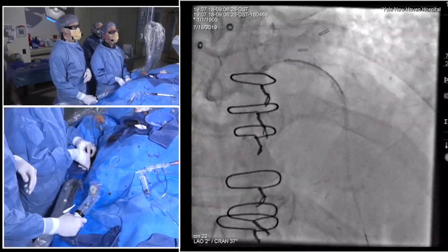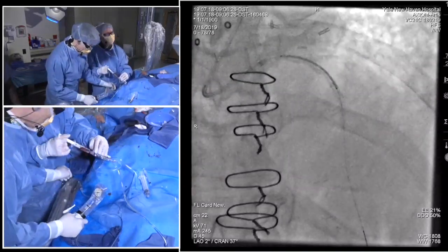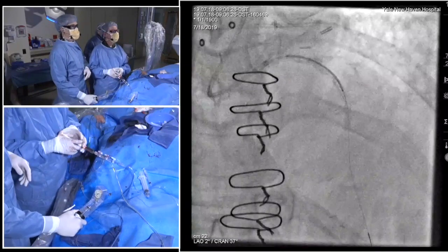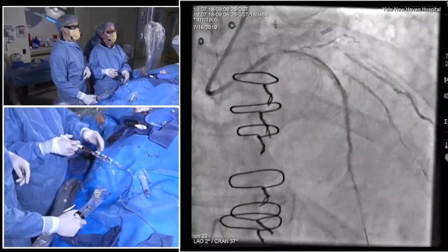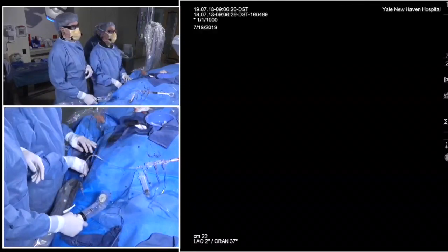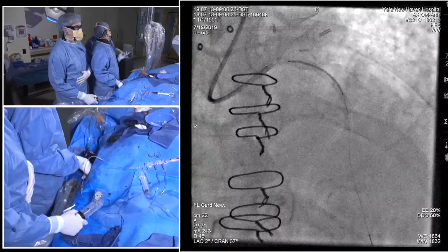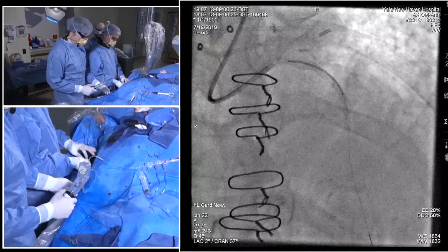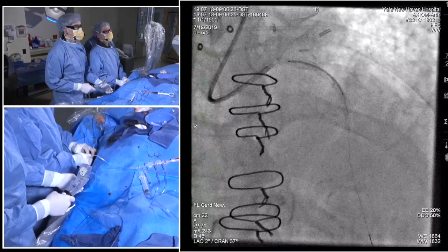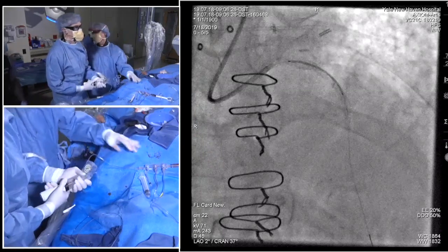No, I totally agree. I think you need to know what's in your toolbox. There are other hospitals that don't have atherectomy. We had a case like this referred in, and fortunately the operator decided to wait and send the patient for atherectomy rather than continue to try to flog forward with multiple calcium issues and get a suboptimal result, because an extra 15 minutes in the lab to do the right thing means a lot for the patient for the next decade.